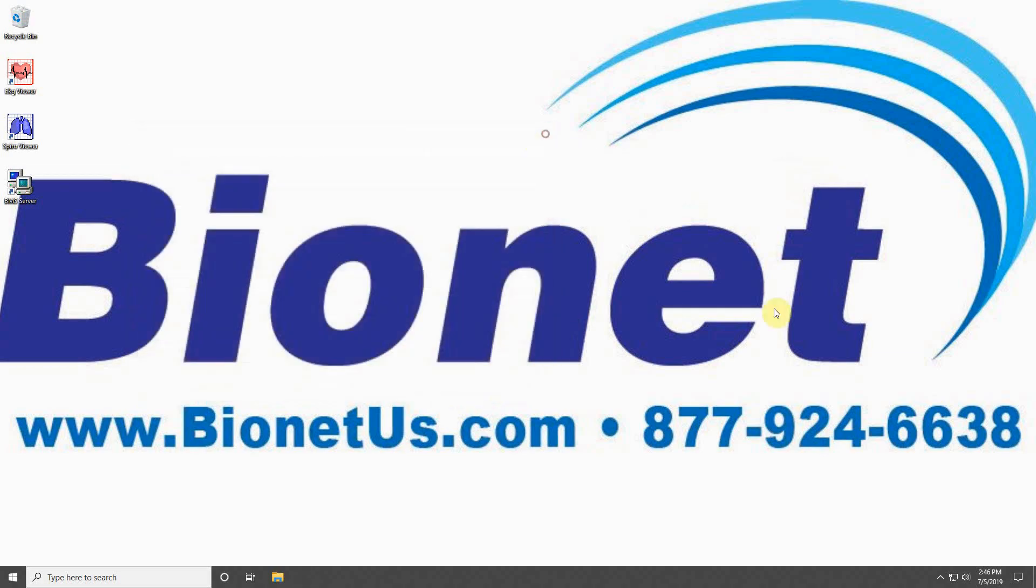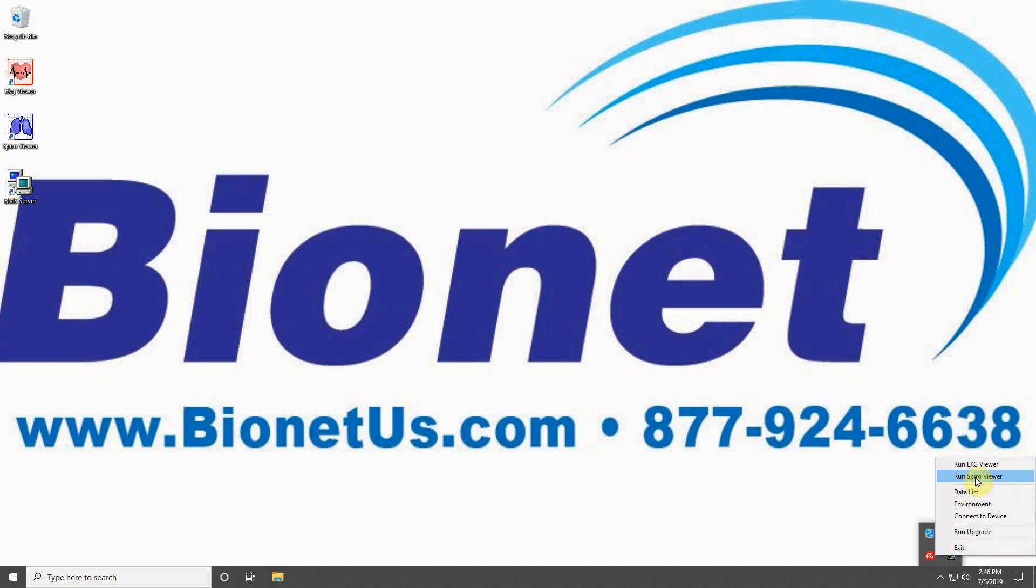The final two links will launch your EKG or Spiro viewer programs from the Server program. These will only work if you have previously defined the program file location under Environment, which was covered earlier. You will not have to utilize Connect to Machine or Run Upgrade. Select Exit if you wish to close the program.